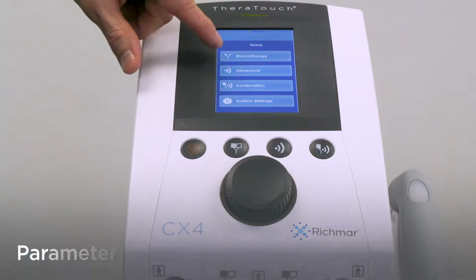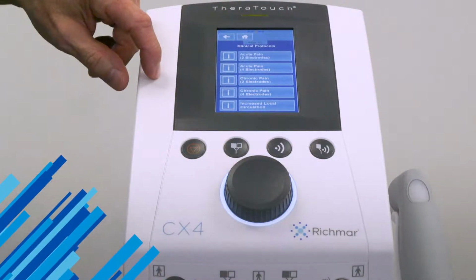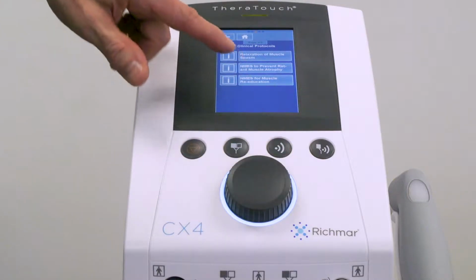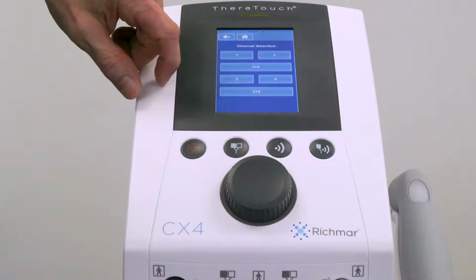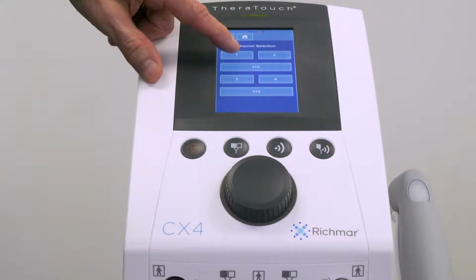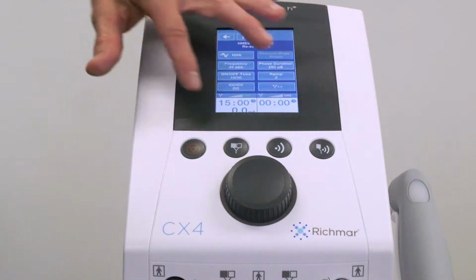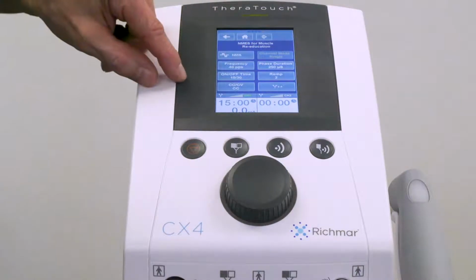From the home screen, I'm going to select electrotherapy, clinical protocols. I'm going to use the dial to advance to the second page. I'm going to select NMES for muscle re-education. I'm going to select channel 1 in this example. And here you see the parameters for on-off cycle time and ramp.